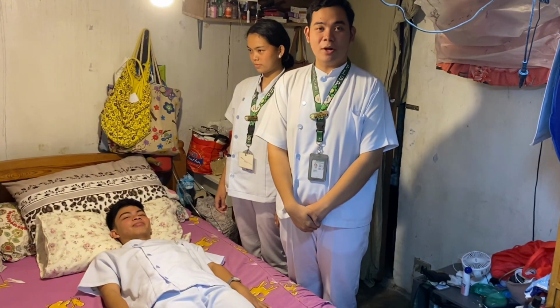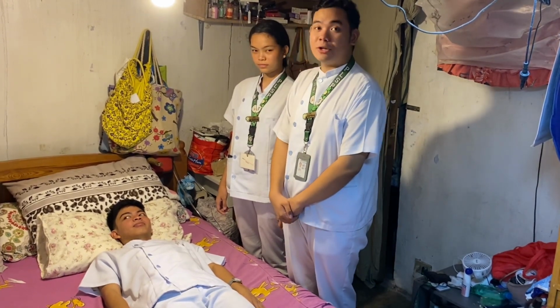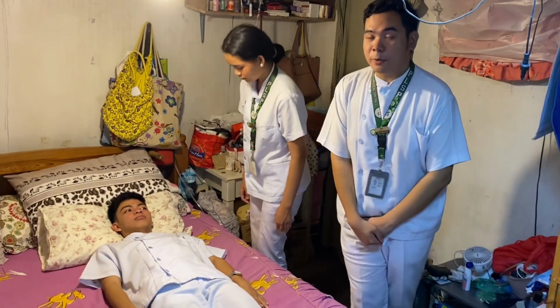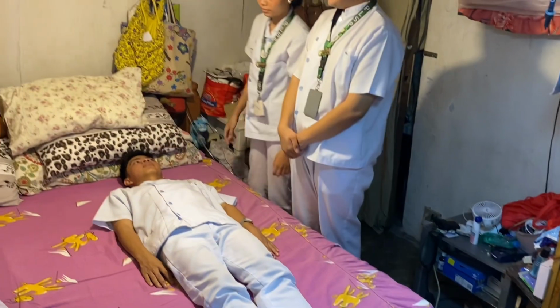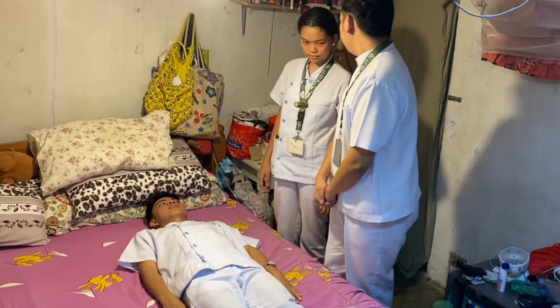So let us now start with the procedure. First, we will adjust the client's bed in preparation for the transfer. We will lower down the head part of the bed to a position that is tolerable by the patient. Okay, so let us assume that the head part of the bed is now lowered. Now we will put a friction reducing device underneath the patient.